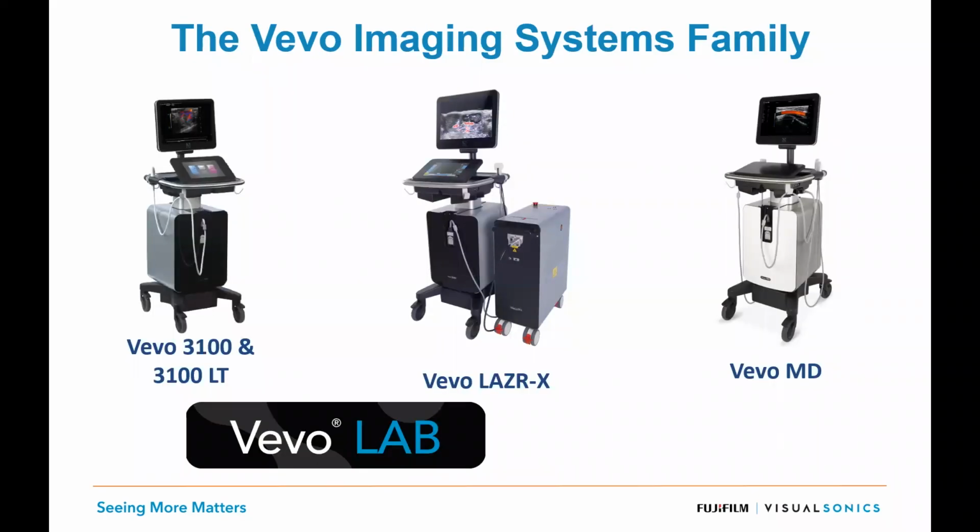So this is the currently offered Vevo imaging system family: the Vevo 3100 and 3100 LT imaging system, with the LAZR-X photoacoustic extension to that system. And then, of course, we have the Vevo MD clinical imaging system, which has regulatory approval in quite a wide number of jurisdictions now for use in the clinic. The preclinical products, of course, I've mentioned Vevo LAB a couple of times. The data from them can be fed into the Vevo LAB Workstation for post-acquisition analysis.